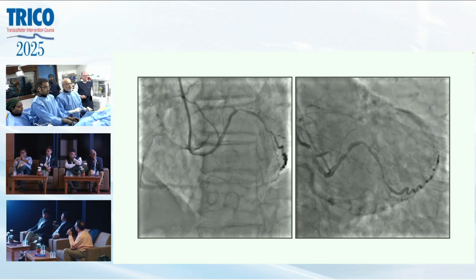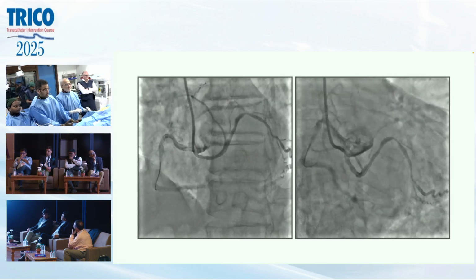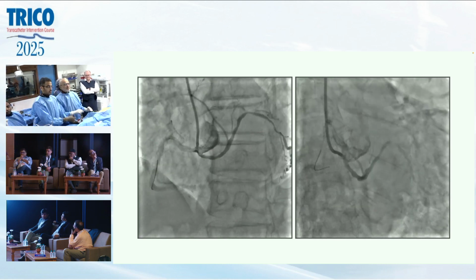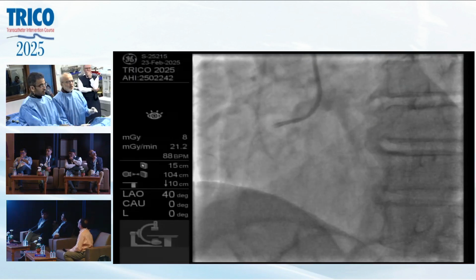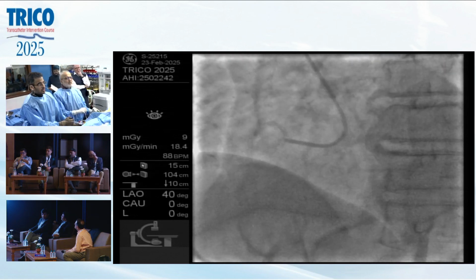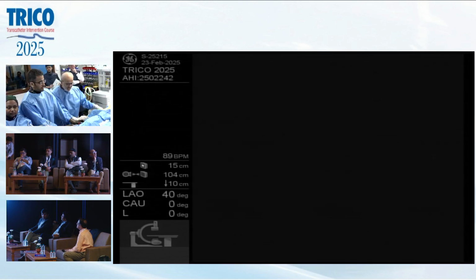This would be a good learning even for the new cardiologist, because you wonder how you are going to do this. I simply cannulate the right first and inject. Can we show the live fluoro screen? Are you not able to see? Now we can, yes. Scout, inject. Right. Let us take one injection here.